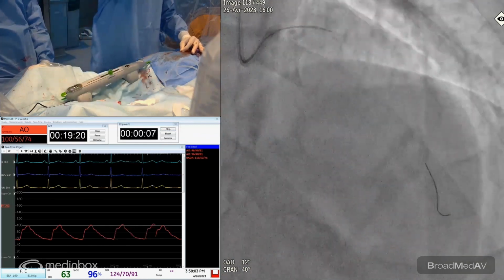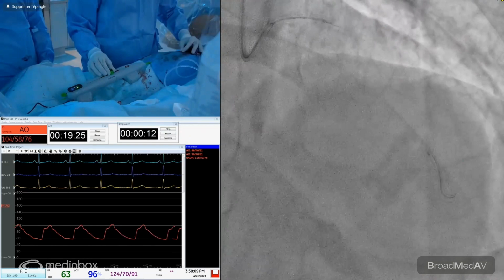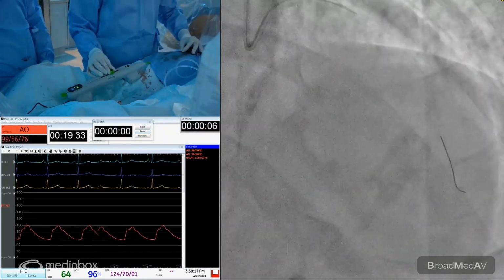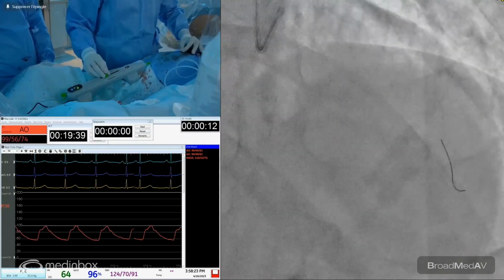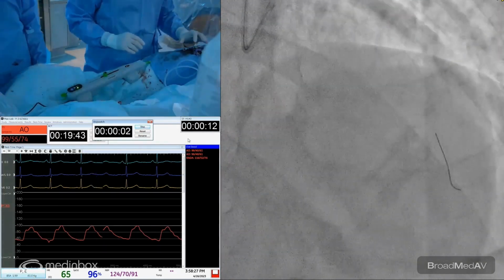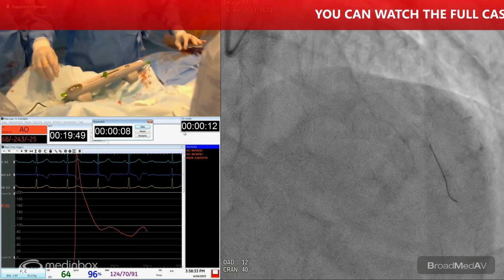I want to make sure to get that bend, to have good expansion afterwards. Here we go. I want to stay away from that second curve because I don't want to go there. Because as you can see, there's a bend while contraction. I do not want to have any stent fracture. So I think this should do the job. We'll do a small test, make sure that things are good. Things look pretty good. And out we go.